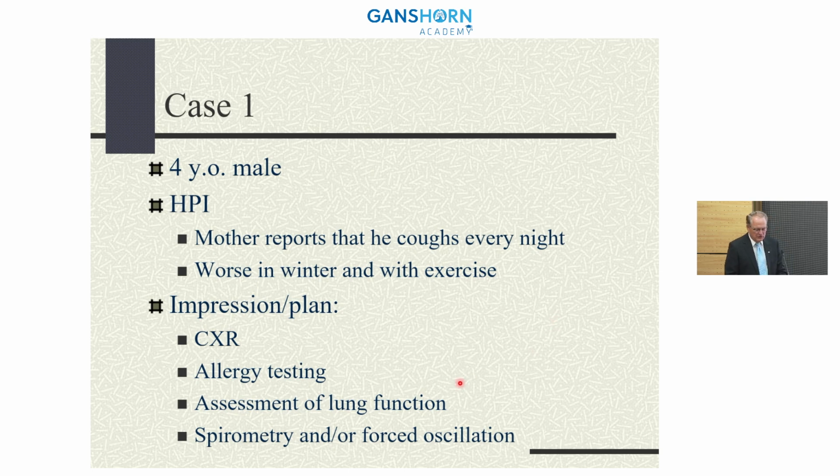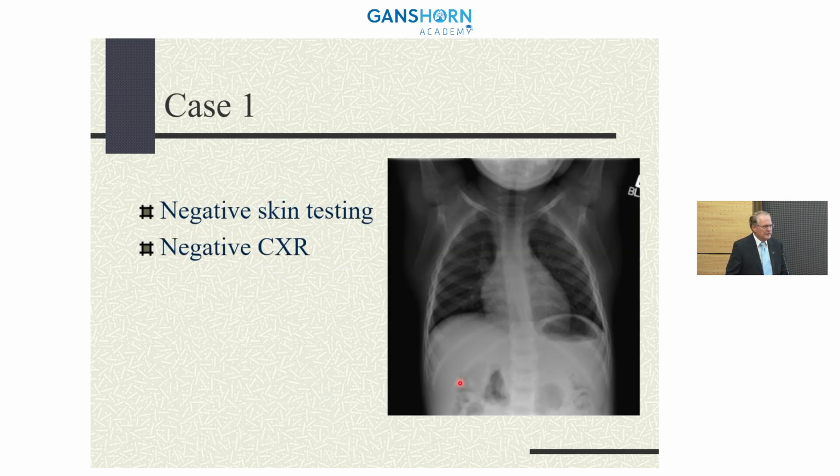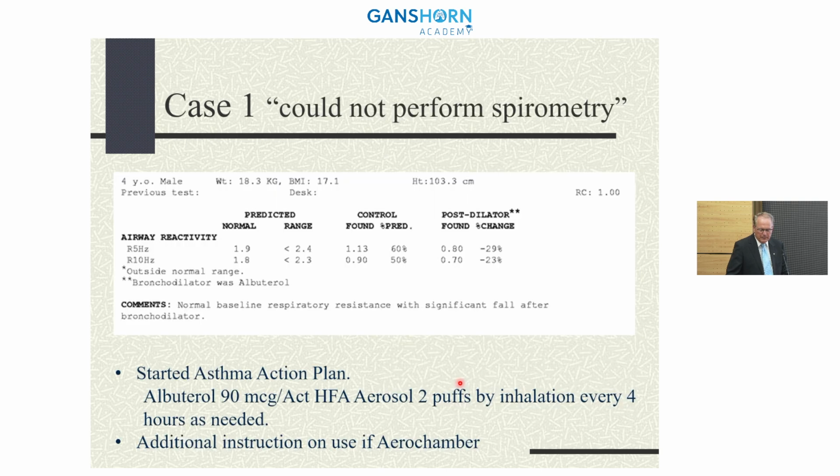In their evaluation, they did a chest x-ray, they did allergy testing, they had the individual scheduled for lung function tests and spirometry. The chest x-ray, of course, came back all negative related to this, and their skin testing for allergies were negative. But they couldn't perform spirometry.